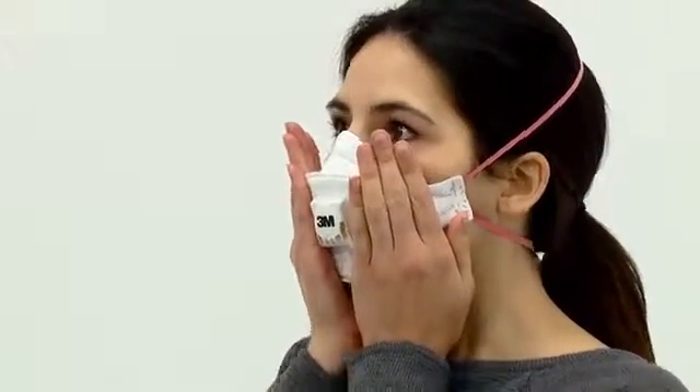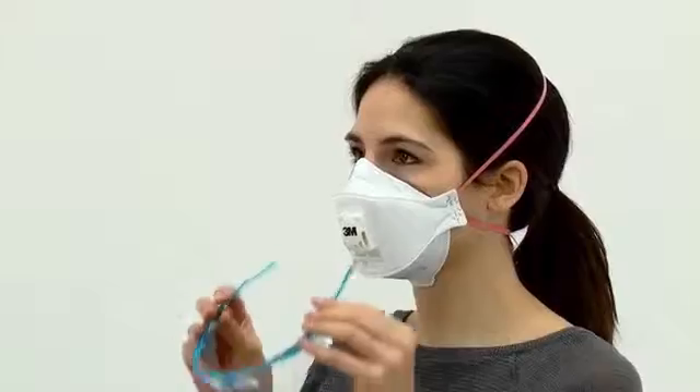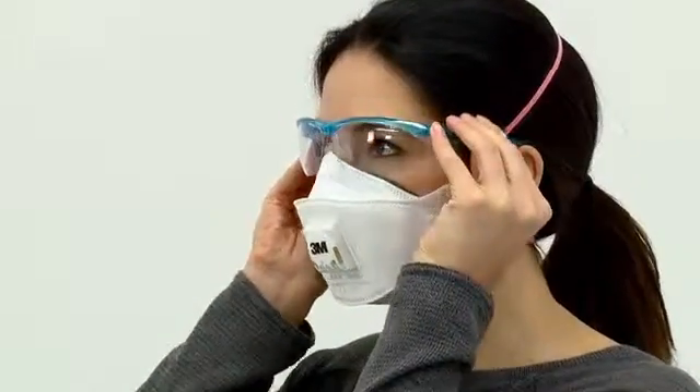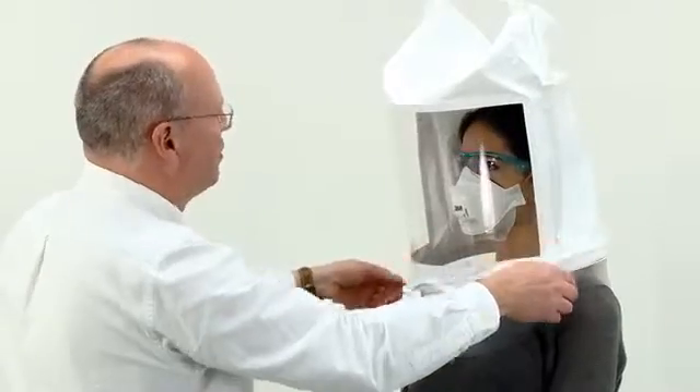After confirming the taste is cleared, ask the subject to fit their respirator and perform a fit check. They should also wear any other personal protective equipment or glasses that will be used with the respirator and might affect its fit. Ask the test subject to tell you if they taste the mist at any time, instruct them to breathe through their mouth with their tongue slightly out, and then fit the hood as before.